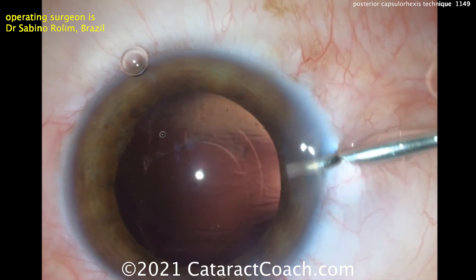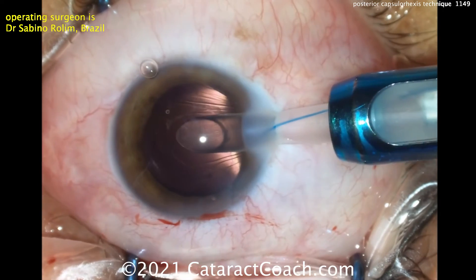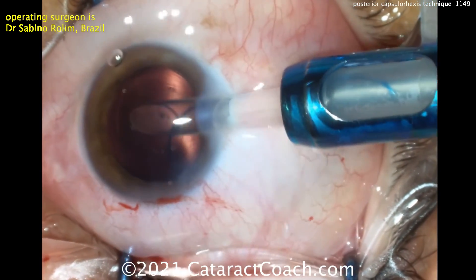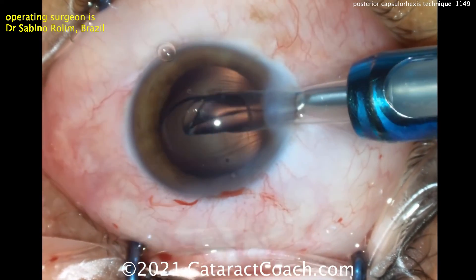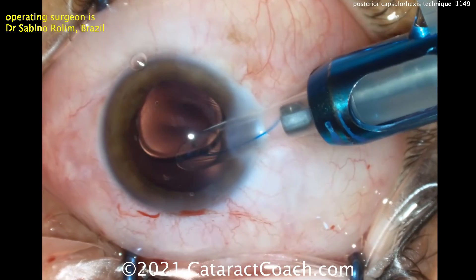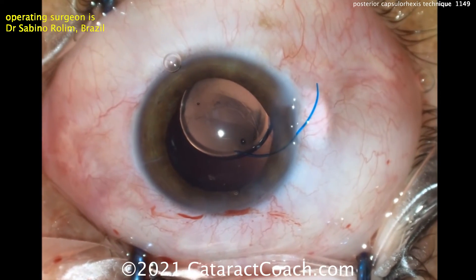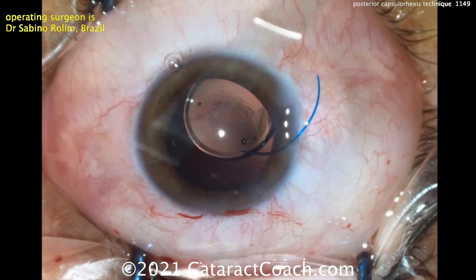A little more viscoelastic going in to open the capsular bag. Think about it — the capsular bag now is like an empty car tire, just a rim of tissue. The leading haptic is going into the capsular bag, then the optic going in nice and gently — beautiful technique — and now dialing in that trailing haptic. A three-piece lens is a great choice here because if there are any issues, it's very easy to adjust those haptics.